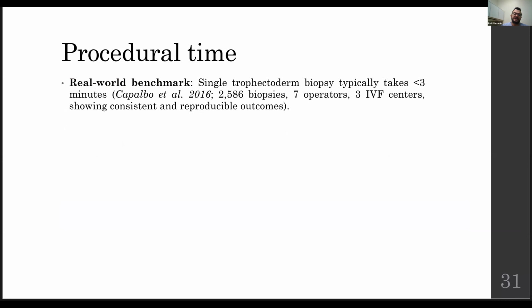For procedural timing, how much time does it take to biopsy? We don't have data, only a real-world benchmark from Capalbo, reporting that a single trophectoderm biopsy typically should take less than 3 minutes. This is a large data set from 3 centers and 7 operators.